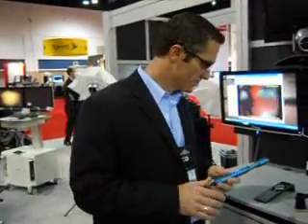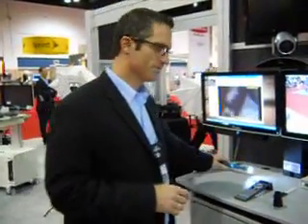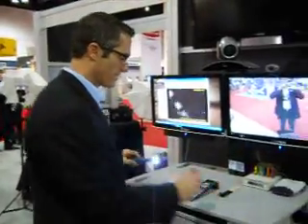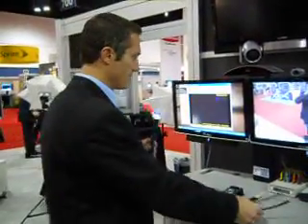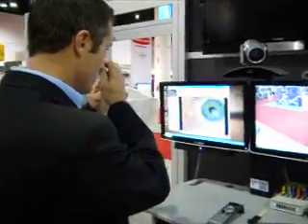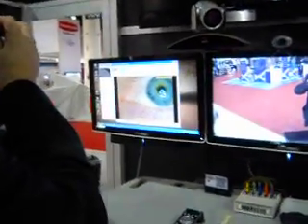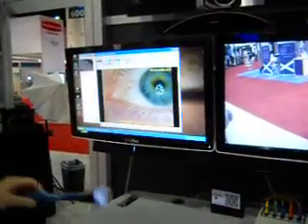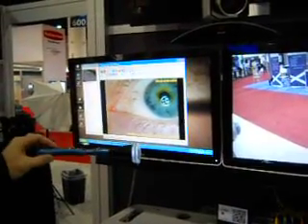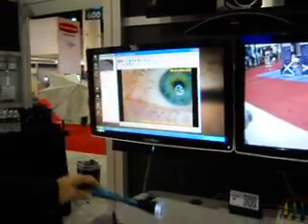Well, it's interesting with the documentation piece. It's said that a picture is worth 1,000 words. So we have our image capture software that, for demonstration, the eye is typically the best way to get the image. Let's get a look. So that is your eye on the camera. This is my eye on the camera. I used the Total Exam with a derm hood on here.